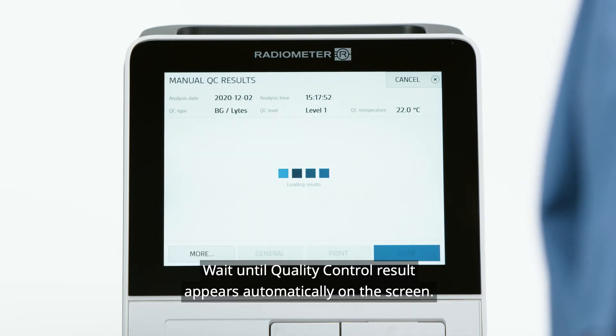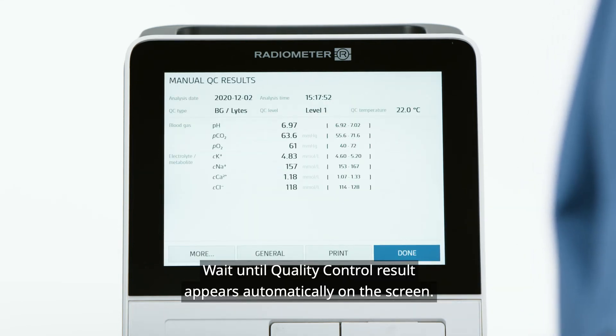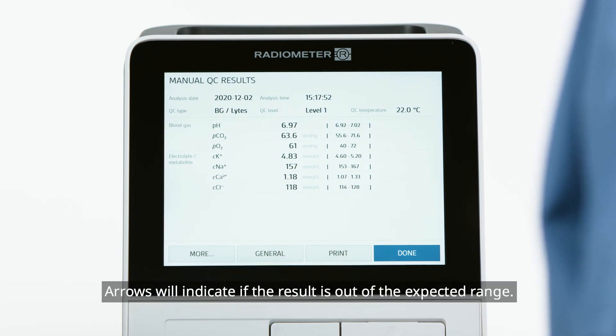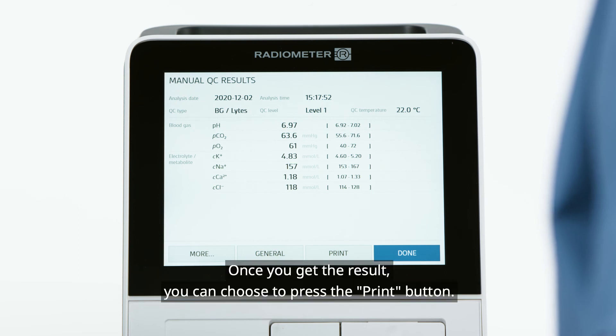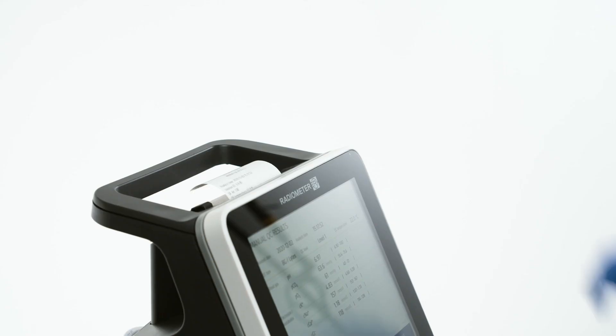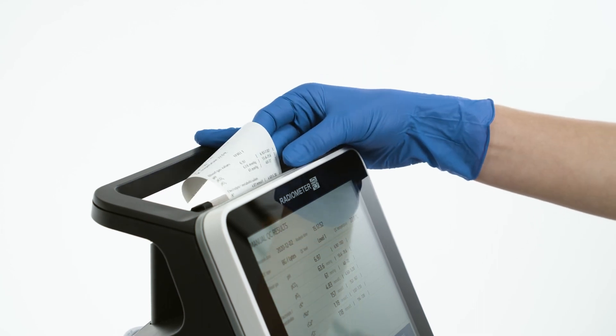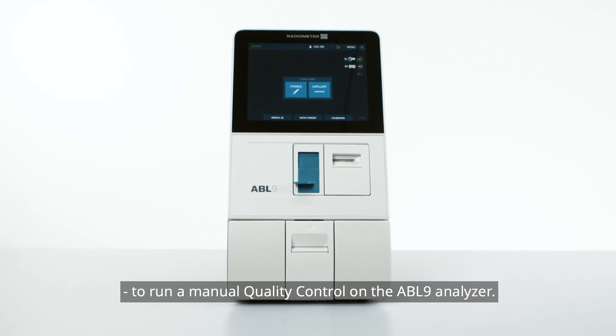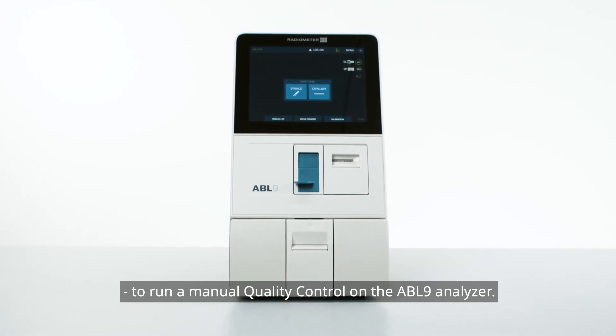Wait until the quality control result appears automatically on the screen. Arrows will indicate if the result is out of the expected range. Once you get the result, you can choose to press the Print button. You have now seen the steps needed to run a manual quality control on the ABL9 analyzer.